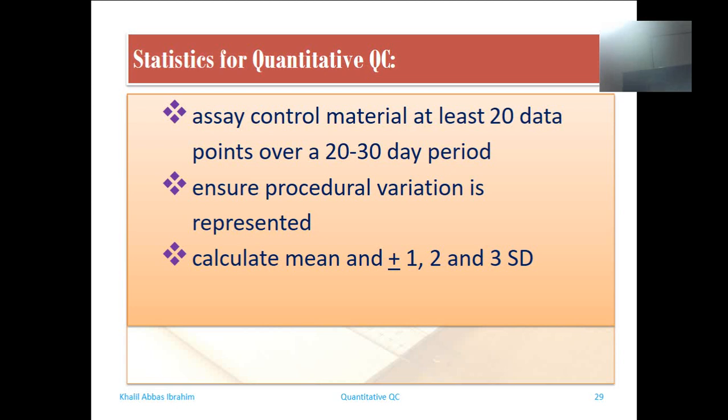For example, if you have 2 or 3 pieces of equipment used together in the laboratory, you need to either examine all the 20 samples on each specific equipment, or examine some of those values on equipment 1, others on equipment 2 and the others on equipment 3, and then merge the values and sum them to count the mean.